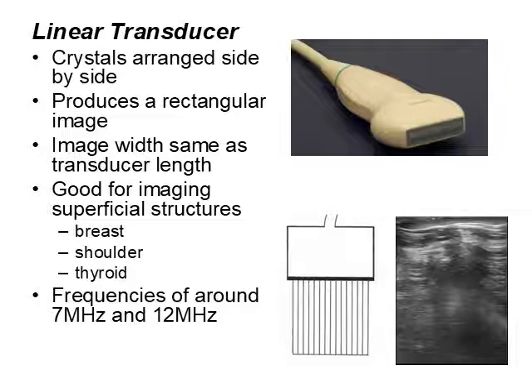The next thing we then have to decide is what frequency. Transducers these days are what we call multi-frequency transducers, in that one transducer will work at multiple frequencies. So we will still refer to them as one number, and that's usually the middle frequency, but our 7 megahertz transducer might work at, say, 5 megahertz, 7 megahertz and 9 megahertz, and by changing a button on the ultrasound machines we can change the frequency of the transducer.